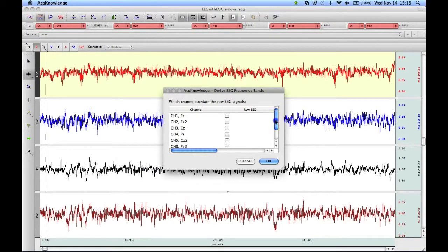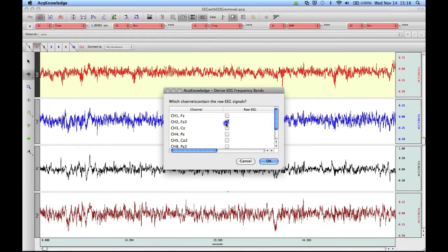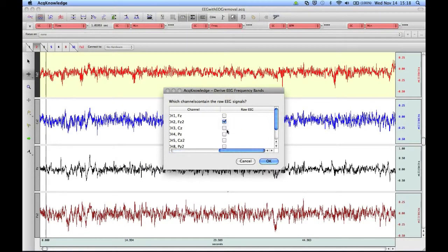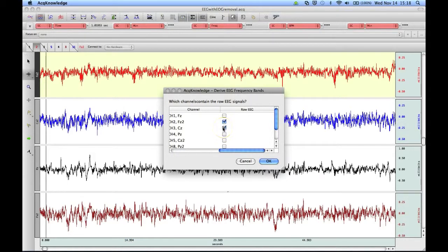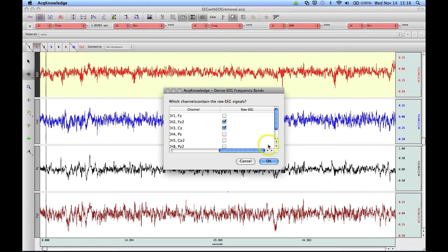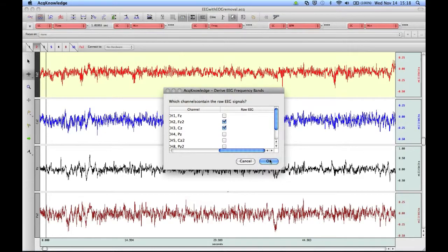Here you'll see our multi-channel selector, and we can again choose the channels that we're interested in for the Derive EEG Frequency Band analysis, and then we can click on OK.